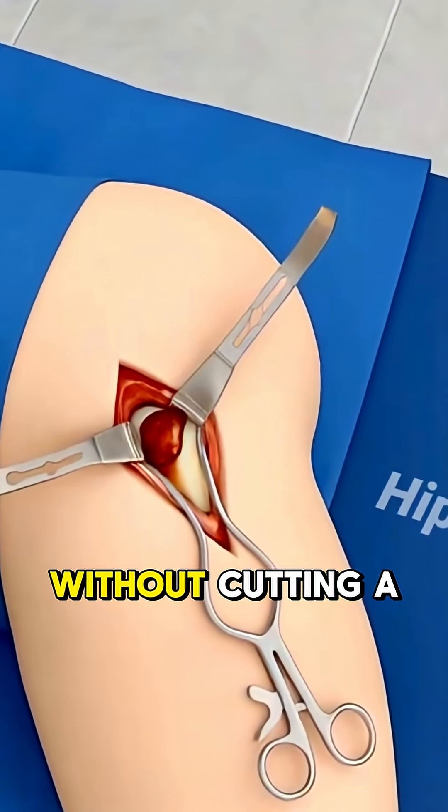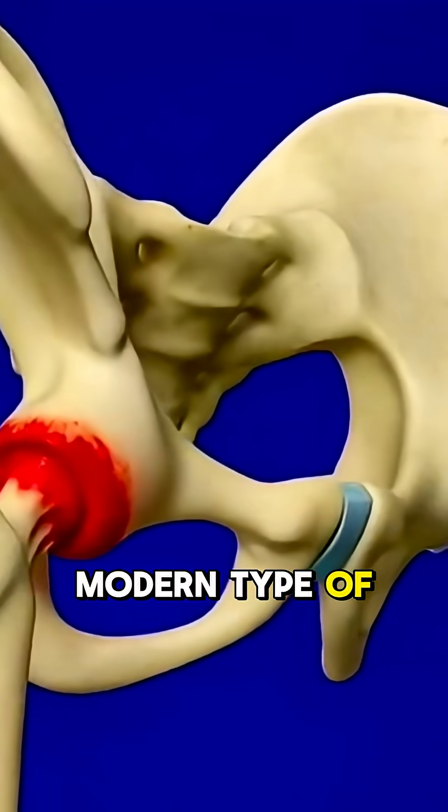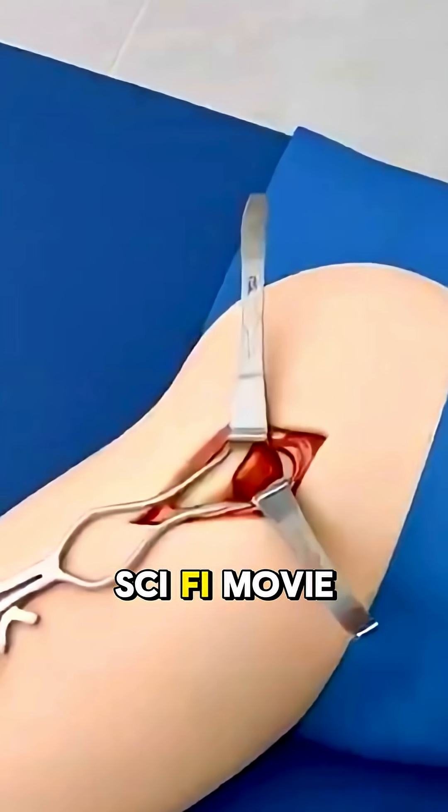What if you could get a new hip without cutting a single muscle? SuperPath is a modern type of hip replacement, and yeah, it sounds like something out of a sci-fi movie.